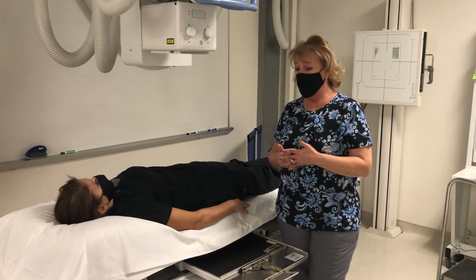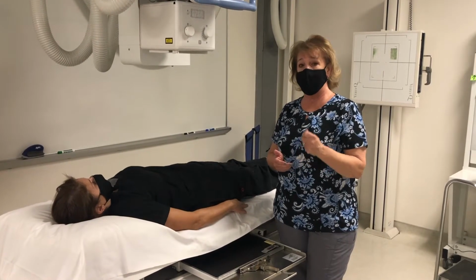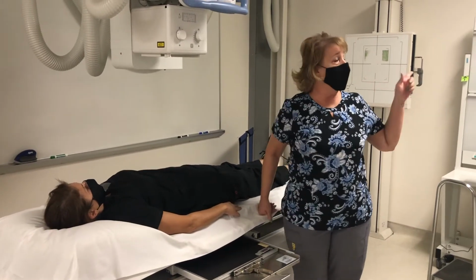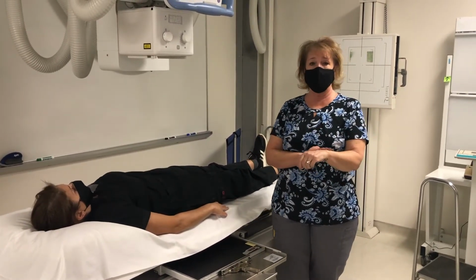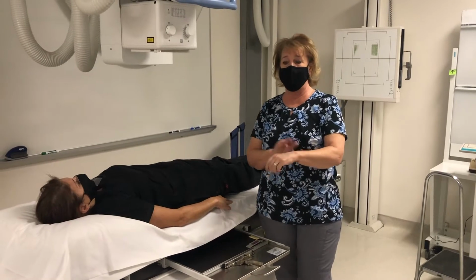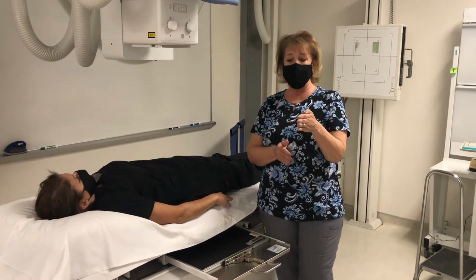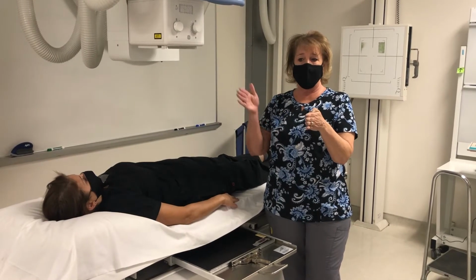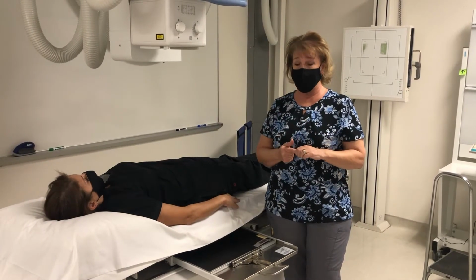And then as soon as I finished that contrast injection, I would somehow mark the clock in the room, or if I was wearing a wristwatch, I would mark it so that I would know what time I gave the injection, because our timed imaging is based on the time you injected.